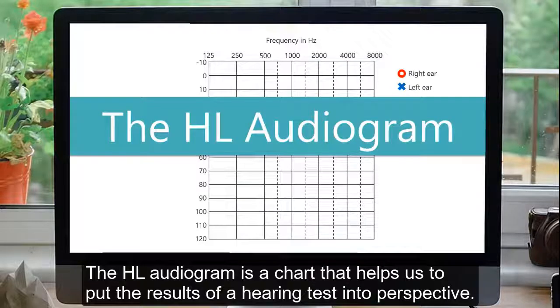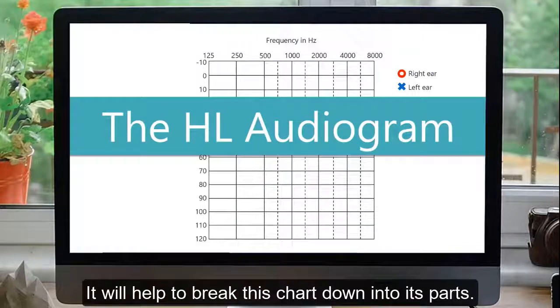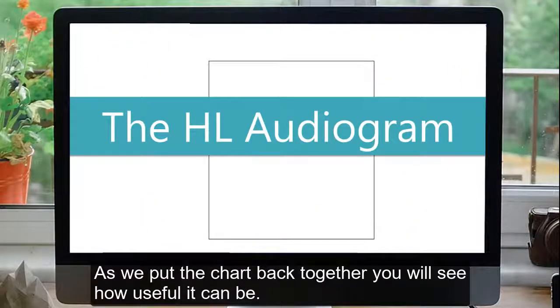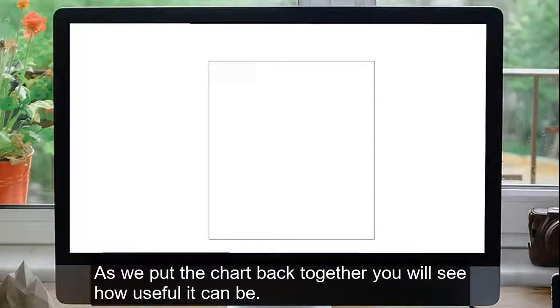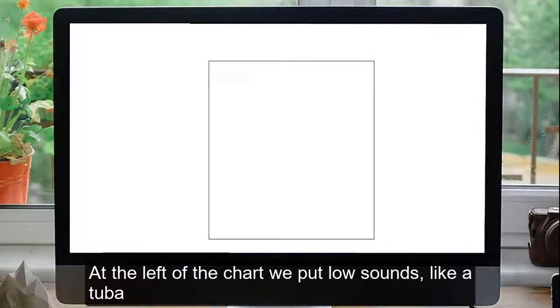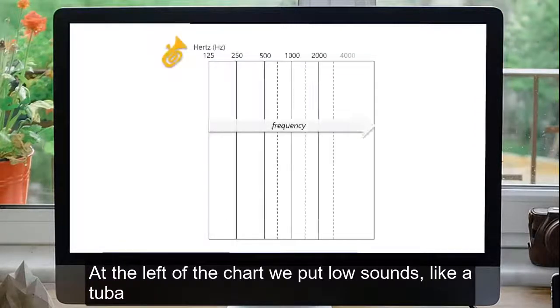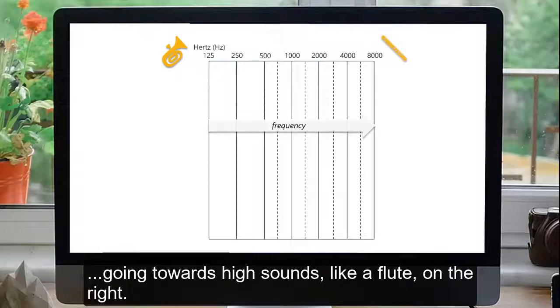The HL Audiogram is a chart that helps us to put the results of a hearing test into perspective. It will help to break this chart down into its parts. As we put the chart back together, you will see how useful it can be. At the left of the chart, we put low sounds like a tuba going towards high sounds like a flute on the right.